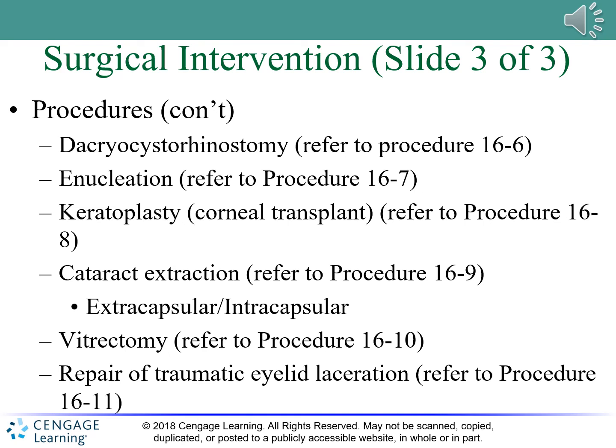You need to write next to vitrectomy that this is an intraocular procedure. So everything up until this point has been on the outside of the eye or on the lens. This vitrectomy is an intraocular procedure. We are going into the eyeball.